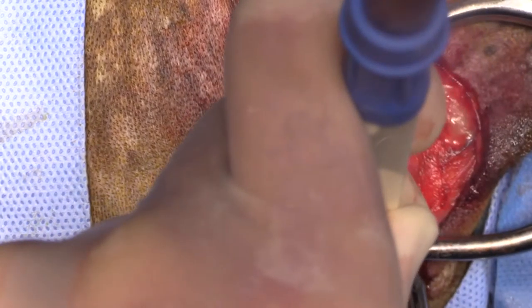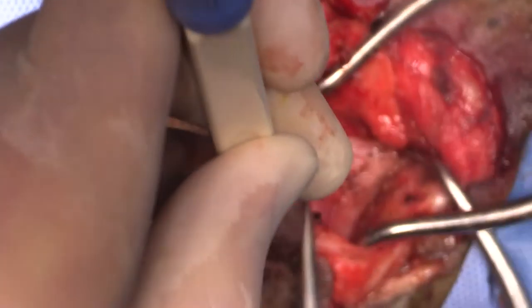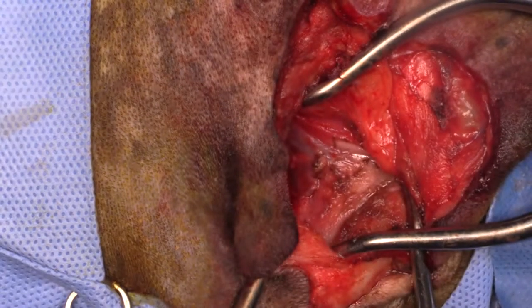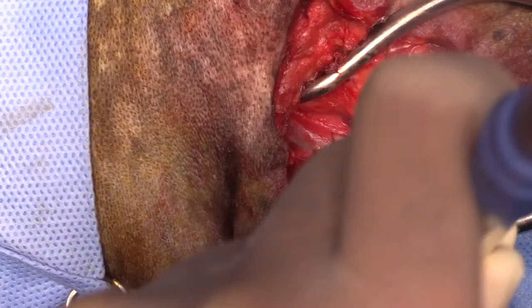Now there's a nice big chunk here. Where's my... Look at that. Nice big chunk there. So that's what is being suctioned from the ear? A lot of exudate is being suctioned out. So basically, ceruminous material like earwax.